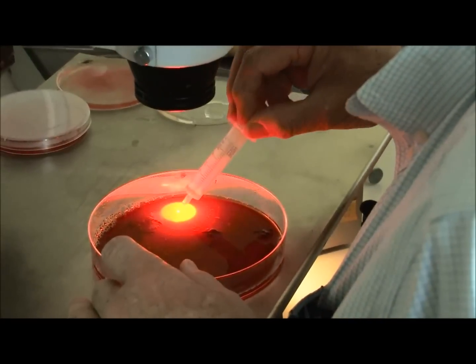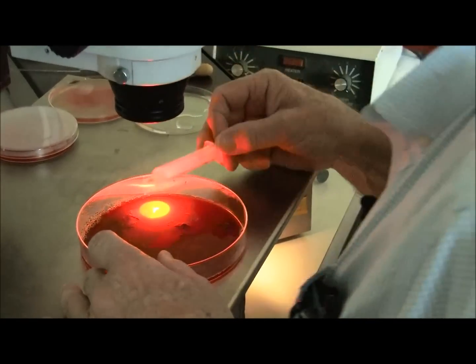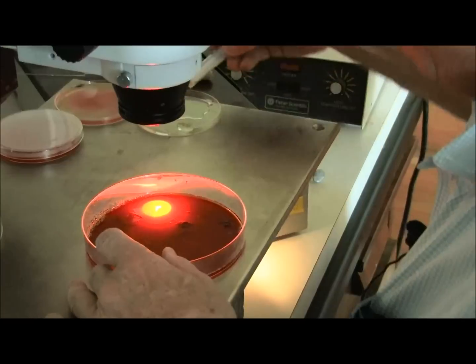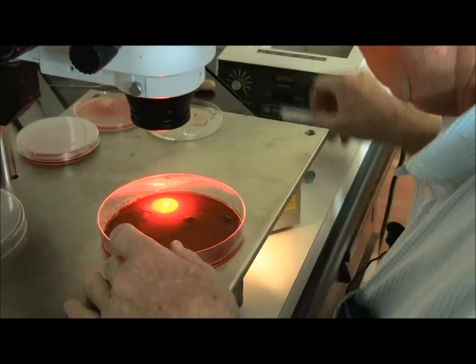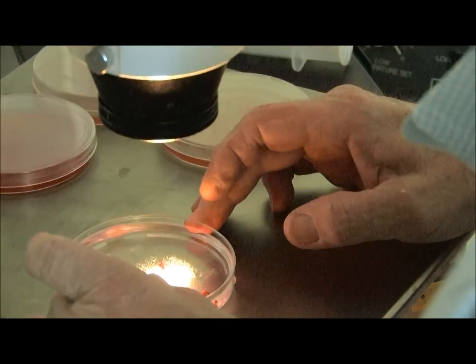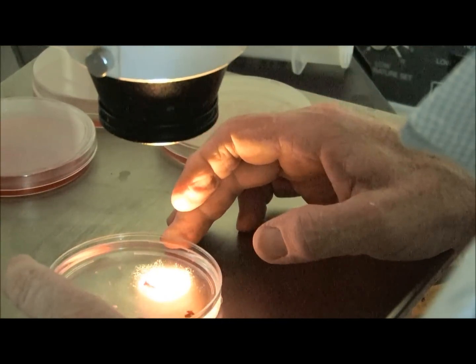Once the oocytes are identified, they're moved from the original search dish into a secondary search dish which is clear of the debris, blood, and fluid, and we find these mature oocytes which are contained in the cumulus-oophorus complex.